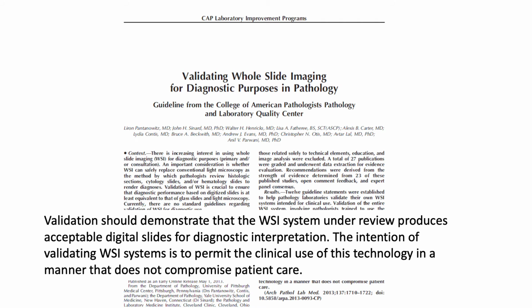Digital pathology is a great tool for pathologists in daily clinical practice, but we cannot forget about clinical regulations, quality assurance, and validation. The first paper about validation of whole slide imaging for diagnostic purposes in pathology was written by Dr. Liron Pantanowitz et al. in 2013, and was a guideline from the College of American Pathologists, Pathology and Laboratory Quality Center. The conclusion of that publication was that validation should demonstrate that the WSI system under review produces acceptable digital slides for diagnostic interpretation.